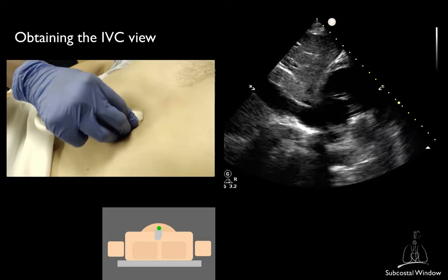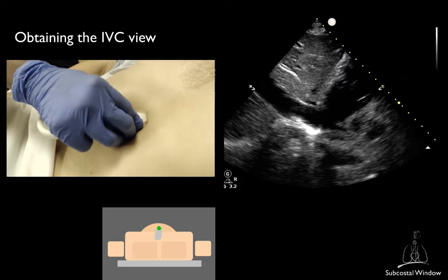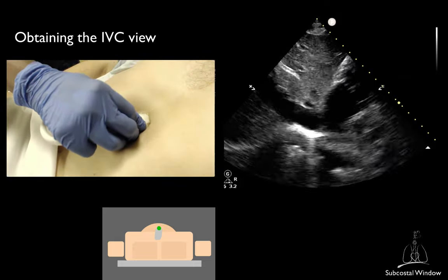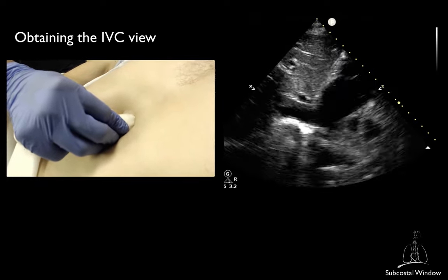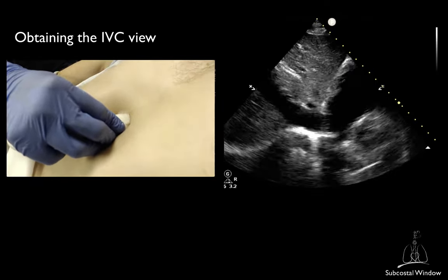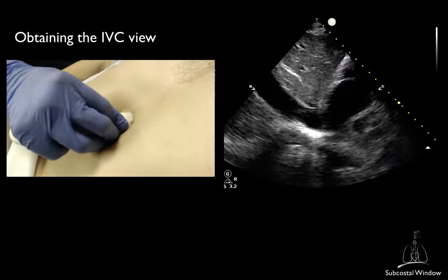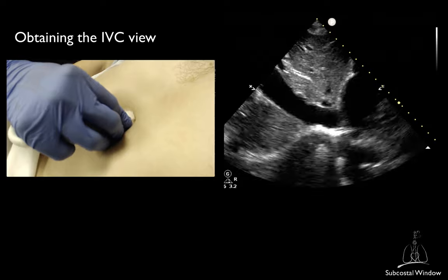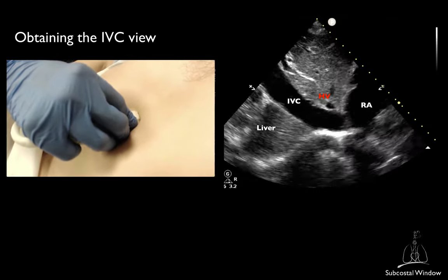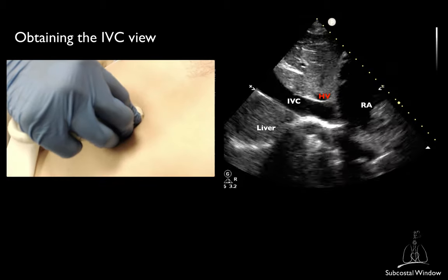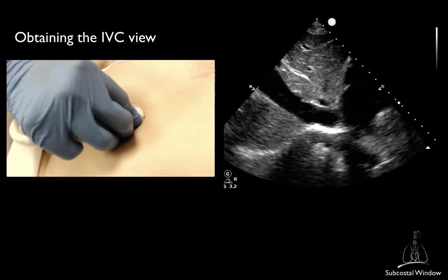You should aim to rotate between 60 and 90 degrees. The marker should be looking towards the patient's head. Fine rotational movement should be applied to make sure that the long axis of the inferior vena cava is imaged. The optimal view of the IVC should allow you to visualize the IVC-RA junction, the liver on both sides, the hepatic vein draining into the IVC, and the IVC should be open as far as possible into the liver.